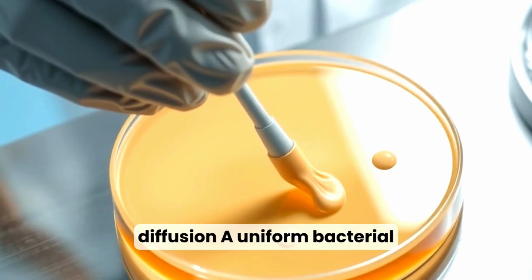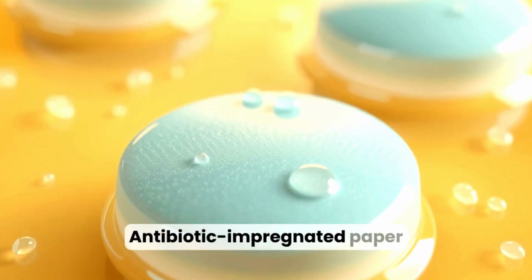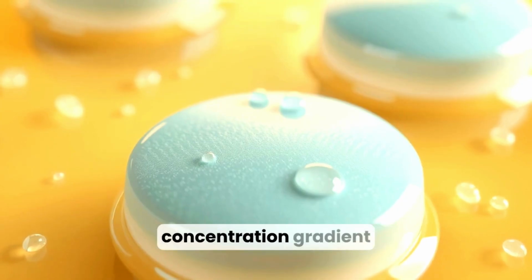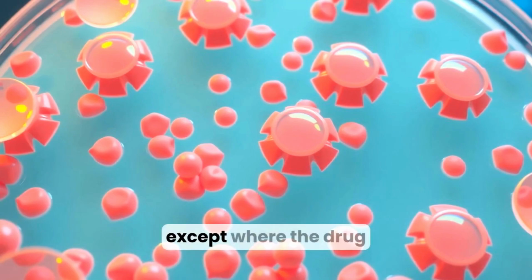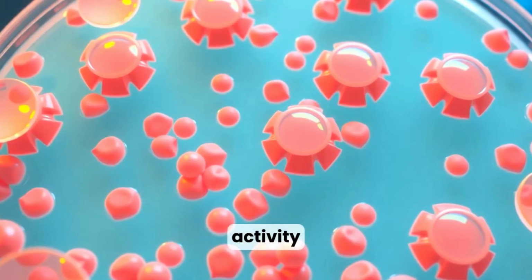A uniform bacterial lawn is spread across an agar plate to create consistent growth for testing. Antibiotic-impregnated paper discs are placed on the surface. Each disc releases drug into the agar, creating a concentration gradient. After incubation, bacteria grow except where the drug concentration is inhibitory. Clear circles, called zones of inhibition, indicate drug activity.